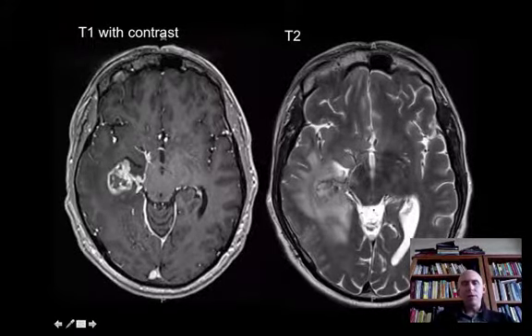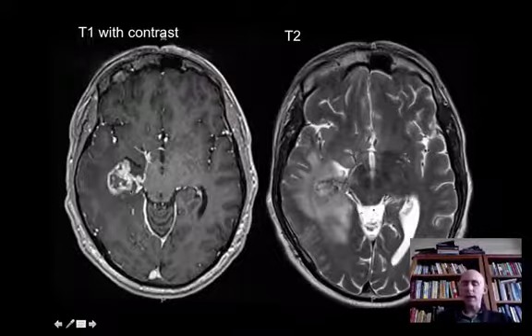So what you really want to encourage is sampling of this deeper, more radiographically abnormal area. So this will not cut the mustard. This is not diagnostic. It does not follow Bill's rule that something should be as abnormal microscopically as it is radiographically.